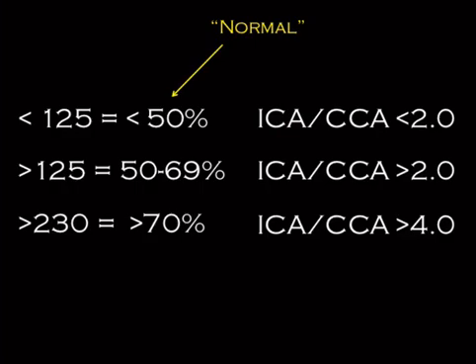And it's also silly for a second reason, which is the classic thing that radiologists do, where they obsess over stuff that's irrelevant to the surgeon. Like, who's the person that's actually ordering this? It's two different scenarios. You have family medicine or heard a bruit. Anytime you have a requisition that says family medicine heard a bruit, you can go ahead and dictate a normal exam.